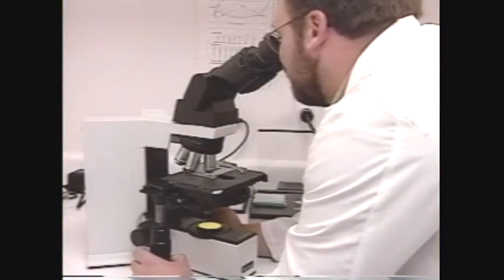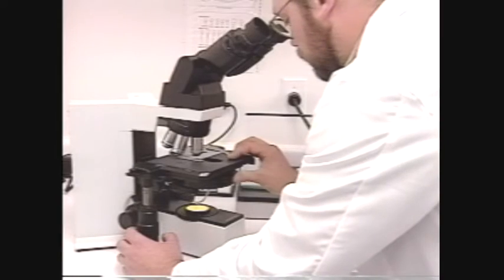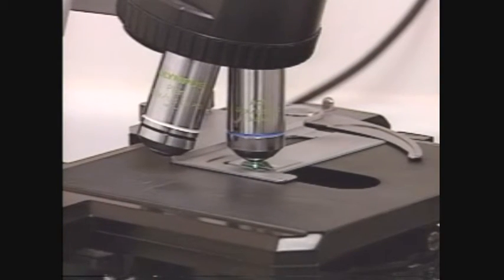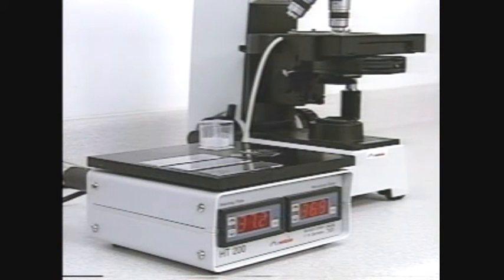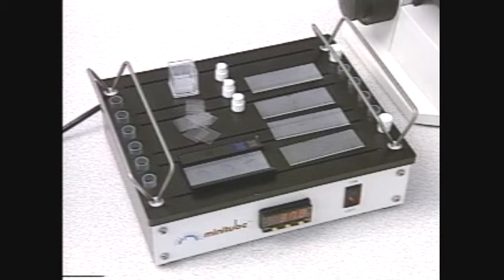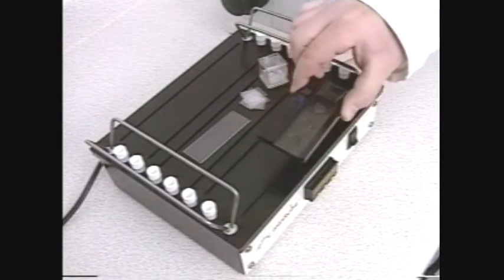The initial semen evaluation should be done at either 100 times or 200 times total microscopic magnification, where a fairly large field of sperm cells can be seen, and then a second evaluation should be done at 400 times magnification to determine morphological quality. A third evaluation at 1,000 times magnification may also be done to determine the acrosome integrity of individual sperm cells. A heating system for the microscope stage should be considered a requirement for use during motility evaluations. All laboratories processing semen should have a slide warmer to pre-warm the microscope slides and cover slips and to keep them warm while preparing semen samples for evaluation.